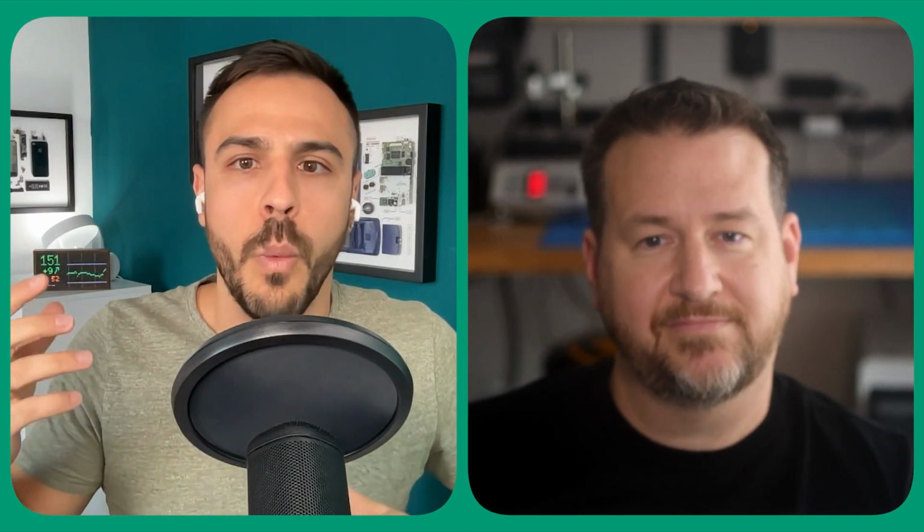Before we get to you and your background, can you just tell my viewers or listeners what is DIY Loop? Yeah, so DIY Loop is an automated dosing system that was not written by a medical corporation. It's written by people that have diabetes, for people that have diabetes, to help them manage all the decisions that you have to manage throughout the day when you have type 1.